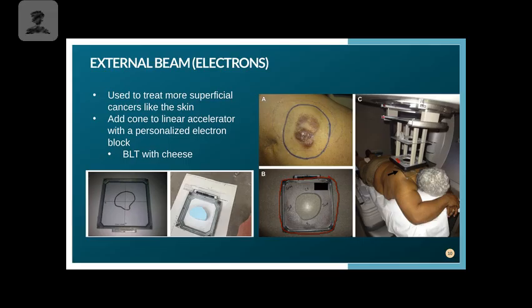So how do we do that? It's actually really cool. This is something that I never knew existed in rad therapy until I was already in school. So this was really new and kind of interesting to me. What we do is we take that metal outside container and place it up within the tray, and there's a little glass panel sitting inside of that tray.